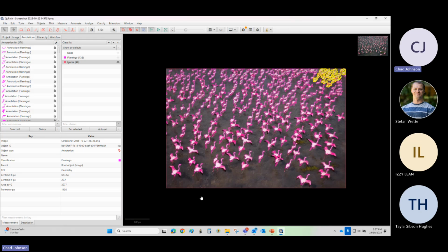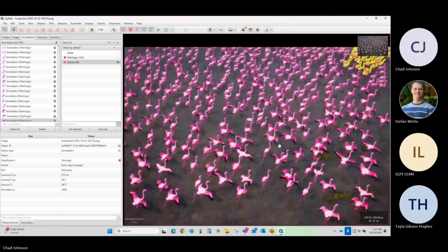So if there are any questions in the audience, no questions. Hey Chad, I do. Yeah. Hi. So you're saying that QuPath doesn't have as good of a statistical analysis. Is there any way to do all of this here and then take it into Fiji, or they're not compatible at all? Yeah, so it actually has Fiji built into it.